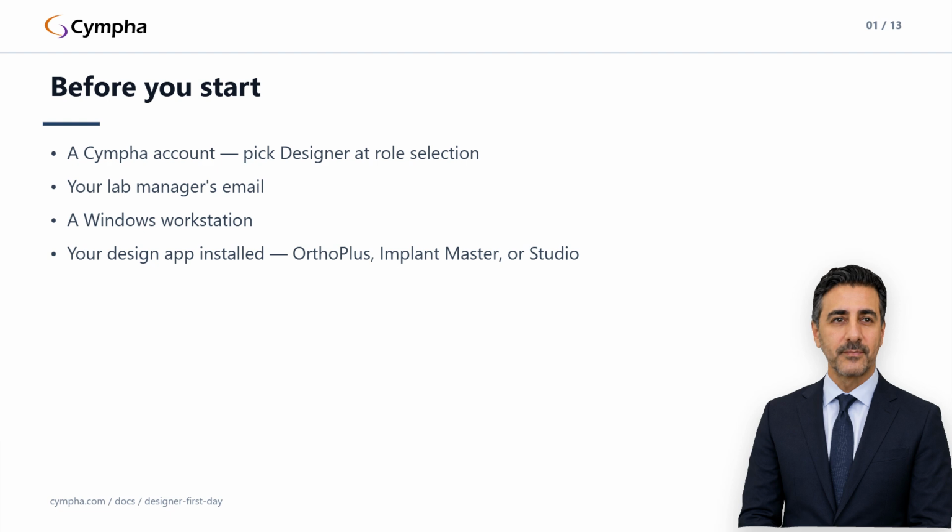And whichever desktop app you actually design in, already installed and licensed. Ortho Plus for aligners and ortho, Implant Master for guides, Studio, or your lab's preferred tool for general design. Cympha doesn't ship those. They come from the Guide Mia site, gm.cympha.com, or from your lab's existing install.